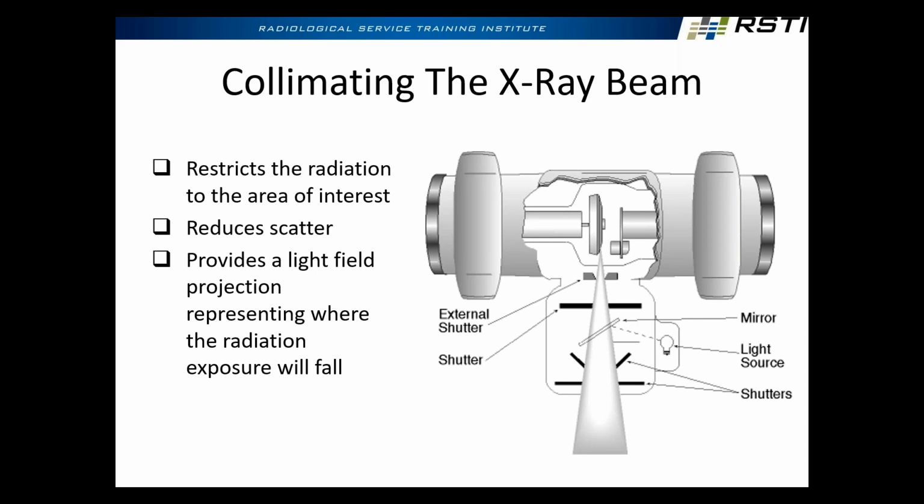Yes, but like I said, they're usually going to be molybdenum or rhodium or silver. Because mammo also works in a completely different range, right? Instead of the 40 to 150 kV range, they'll be in the 20 to 40 kV range. So much, much lower kV. And since it's at lower energies, they don't necessarily have to have a solid tungsten target. So you will see some systems where the anode will be tungsten, but inlaid into it, they'll have a track of rhodium and a track of whatever they're using, right? So they can do it that way as well. They can either use those specific materials to generate the X-rays, or they can filter the beam using those materials.